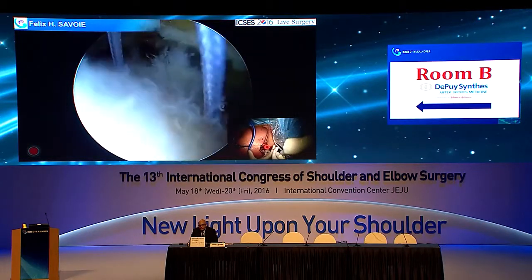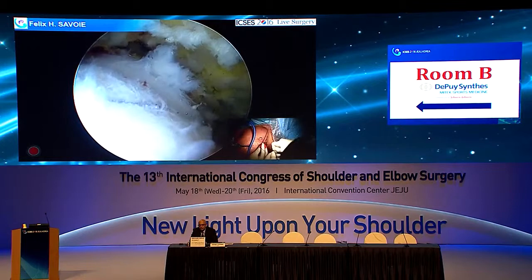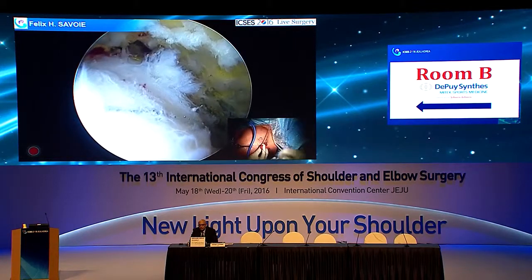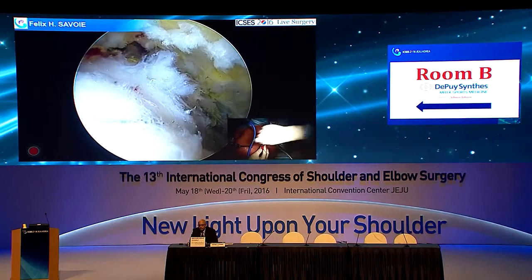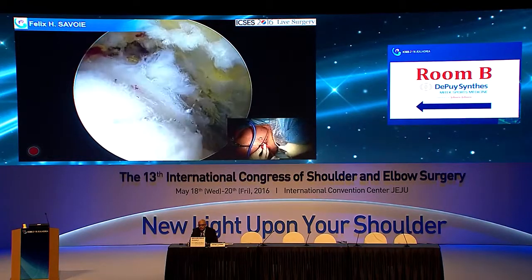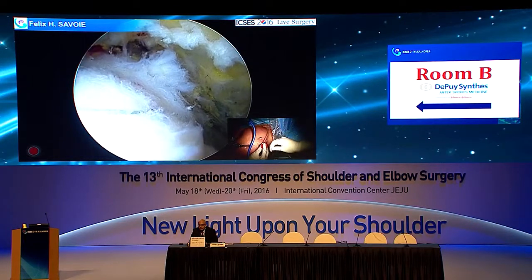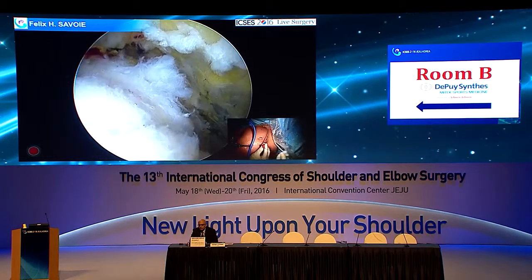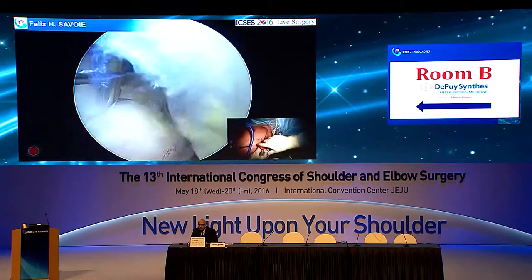If I was going to do 2 medial anchors, if it was a big tear, I would do something like that. I might keep the middle ones and crisscross them. But because of how we put the anchor in anteriorly, when we bring our lateral row a little bit more posteriorly, it'll be 1 centimeter back and 1 centimeter down was sort of the plan. Then that should actually pull it back and right over the top.